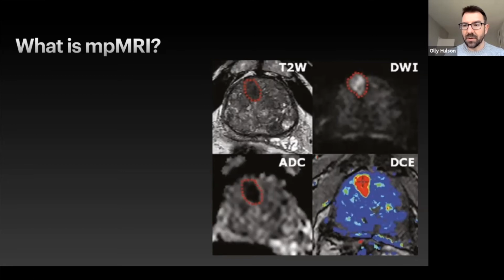And there's lots of work going on across the country and across the world in both of these domains. And certainly in Leeds and in Yorkshire, we're looking at rationalising our MRI protocols across the region to improve the quality and also to improve the reporting and sharing of information throughout the region. The benefits of this also are that it can help to target our biopsies and also target the therapy. And I touched on focal therapy before.